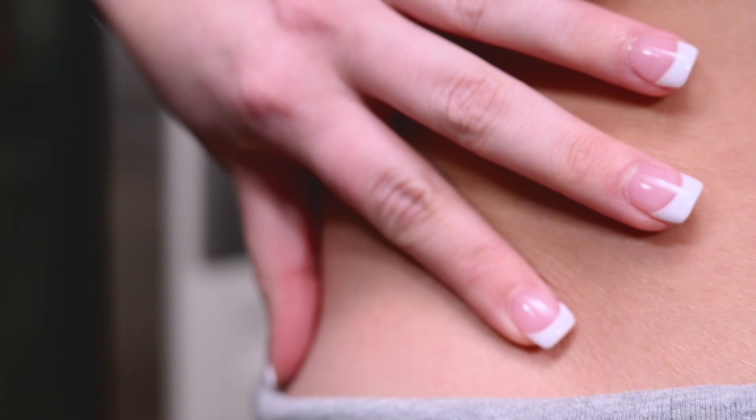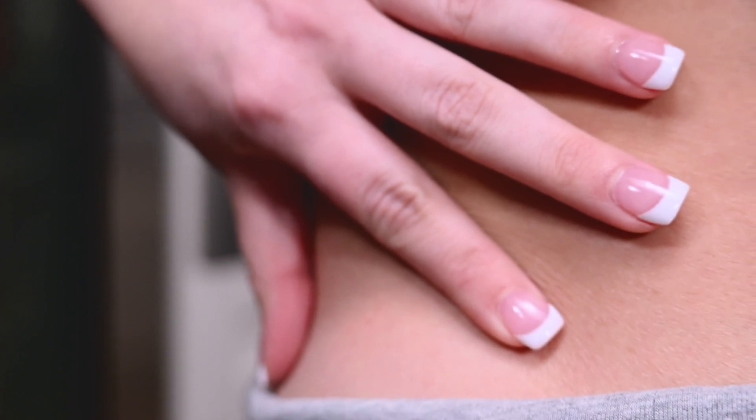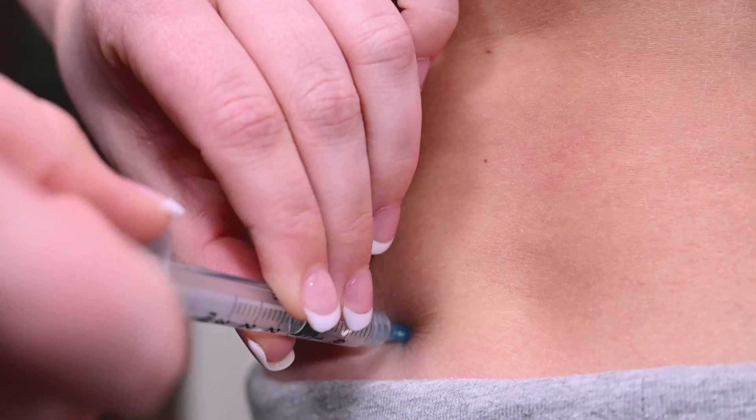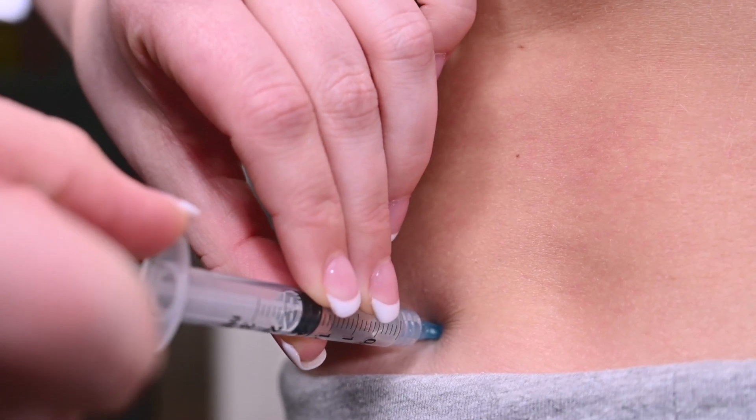Take the syringe in your preferred hand. Stretch the skin between your fingers at the injection site and insert the injection straight into the skin. Pull back slightly on the plunger. If no blood enters the syringe, proceed with the injection.